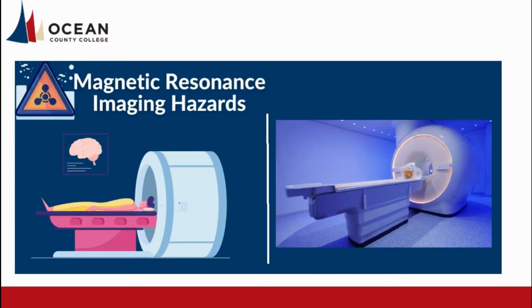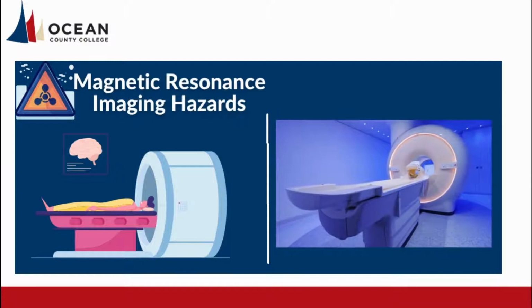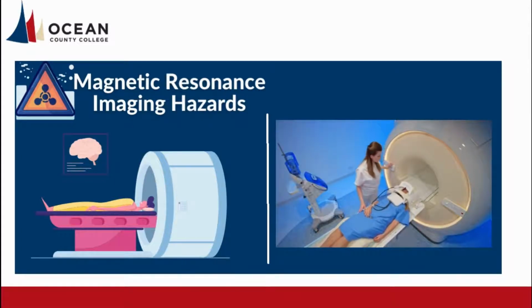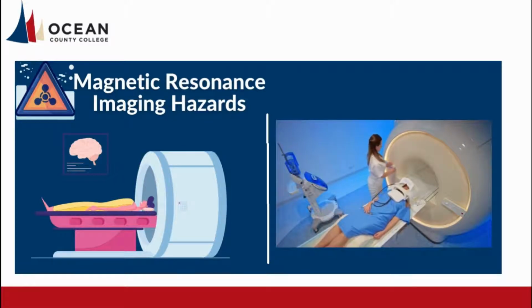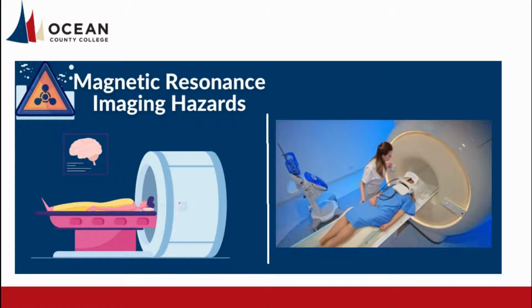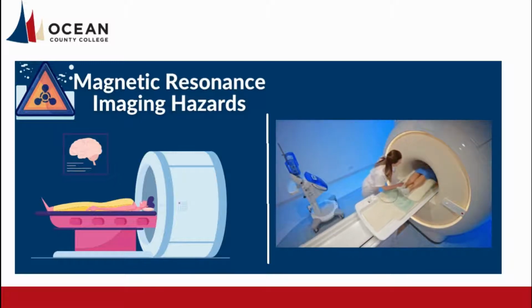A magnetic resonance imaging (MRI) machine uses an extremely powerful magnet to create images of the body. The strength of the magnet poses significant safety risks when proper precautions are not taken. The magnet is strong enough to pull metal objects toward it from across the room at great speed. Warning signs are posted outside the MRI examination room. Anyone entering the MRI examination room must remove all metallic objects, including jewelry, belt buckles, and even zippers. People with implanted metallic devices may be barred from entering. The instructions of the MRI staff must be followed to prevent serious injury or death.